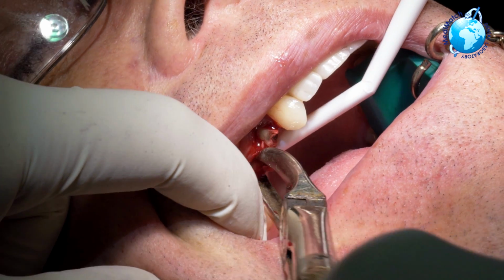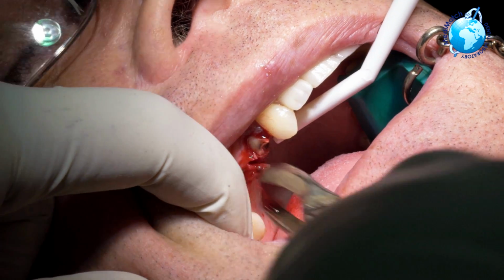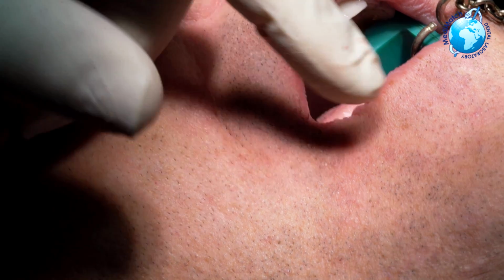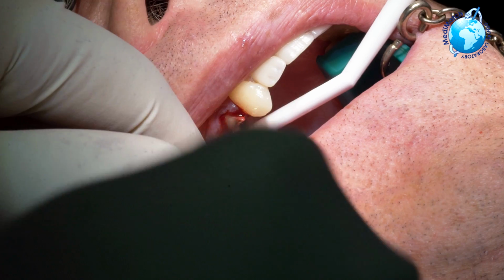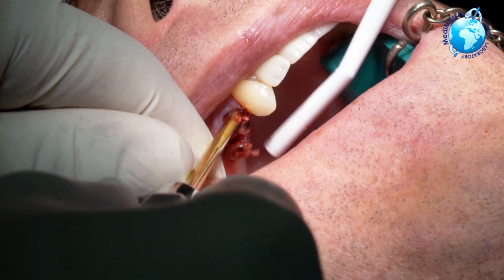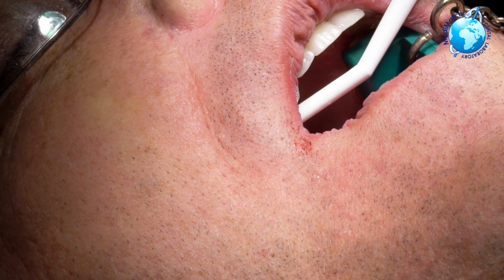Alrighty. So we're just easing it now, not forcing anything. And then we're just going to ease up a little bit more on the root. Okay, Marzena, can I have the wider luxator now, please? That's fine.